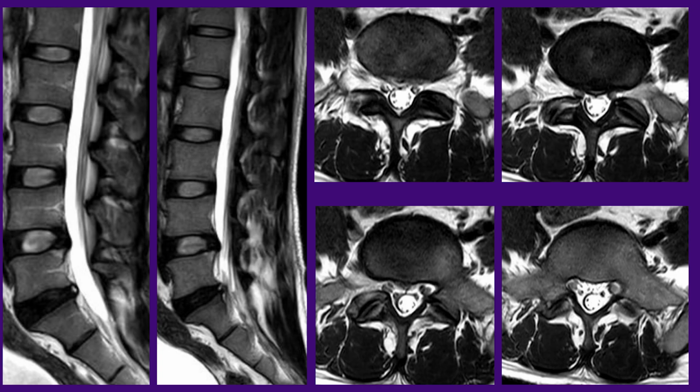So this patient was classically having S1 pain, so I simply ignored the L4-L5 level here. At the L5-S1 level you can see there is a central annular tear, and in the paracentral image the annular tear is opening towards the superior upper end plate. In the axial MRI you can see there is a central annular tear, not too much compression here, but if you give proper attention to the right-sided facet, you can see it is showing some hyperintensity compared to the left-side facet.